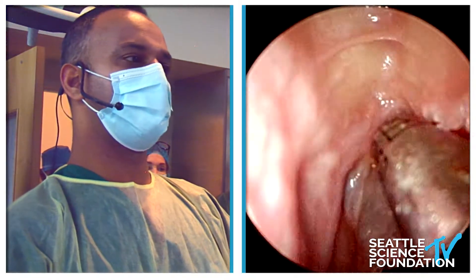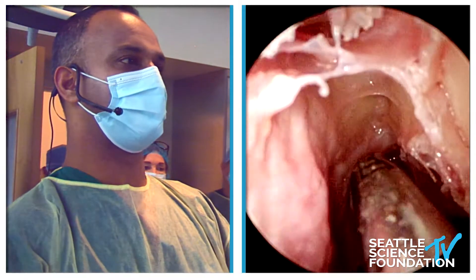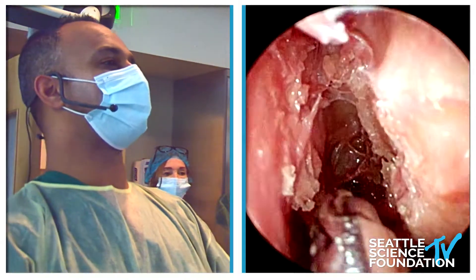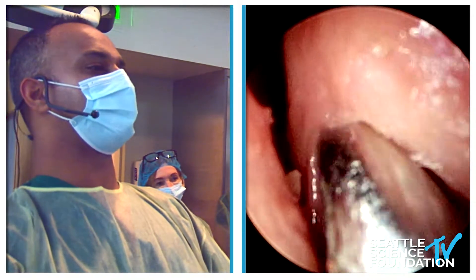Sphenoidotomy, orbit going all the way up, skull base, posterior ethmoid artery that is there. And Winston didn't make that complication, but aimed for a different one here. And then I just want to show you about the importance of angled endoscopy, because Winston had a 30 on, which kind of gave him a lot of that flexibility.